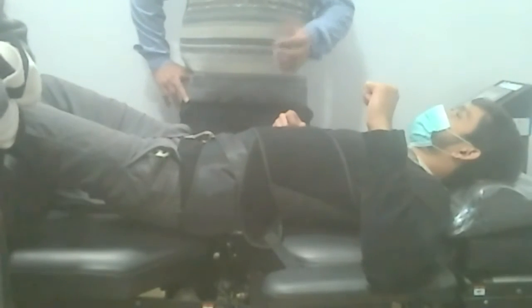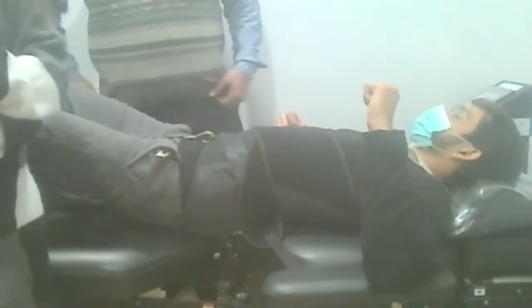It's now getting up to 16. And it gets easier. In 1 to 2 months, you'll have all this down, no problem. It's a lot at first, but once you get used to it, it's actually not that bad. It would have been wonderful if you had been there in Pakistan. But I have videos that you can watch, and I have lists that take you step by step through exactly what to do.